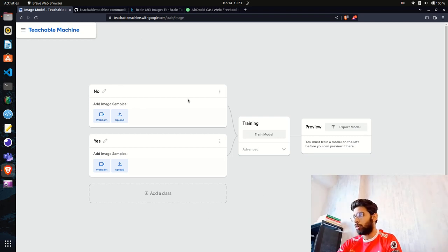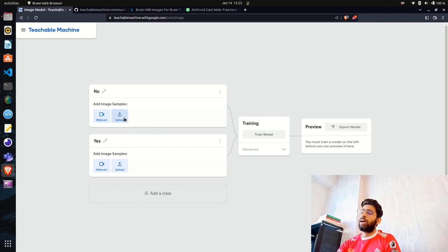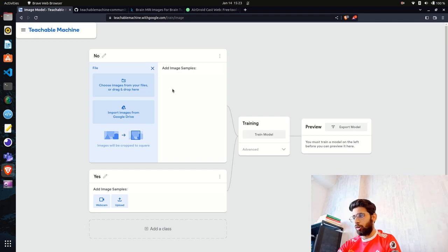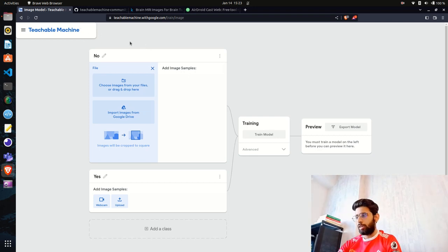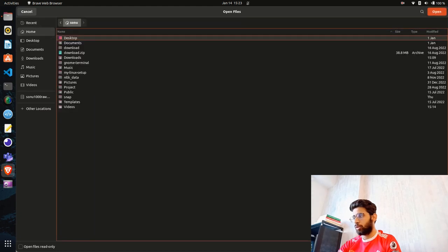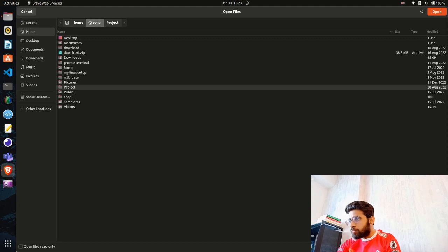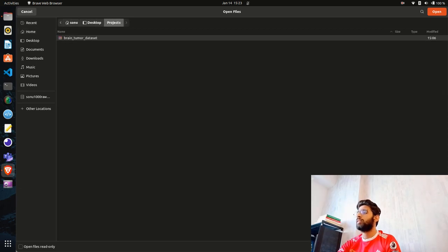Since we selected an image model, we need to upload images. It says 'Choose images from your files.' You can upload from your local machine or import from Google Drive since Teachable Machine is built by Google. Let me go to my project folder — I have the brain tumor dataset here.